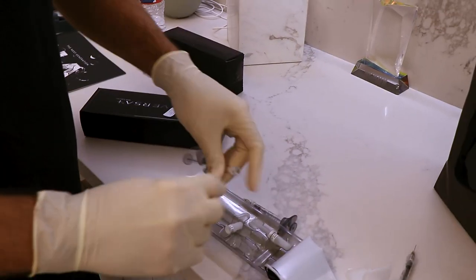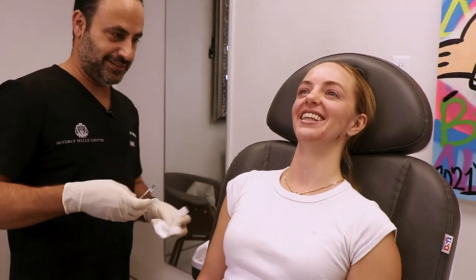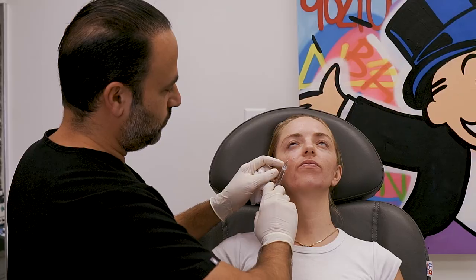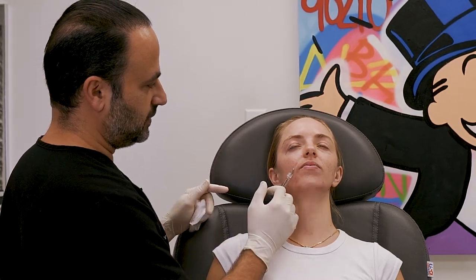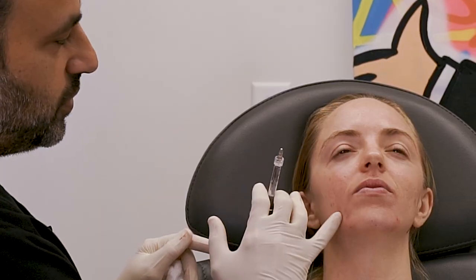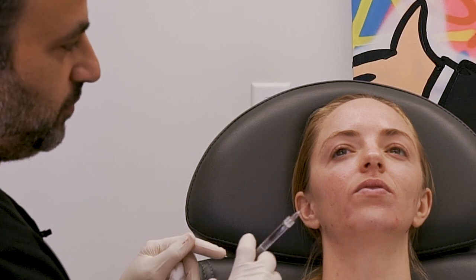Two ways to fill nasolabial folds: one is the actual fold to pop it out, the other is the crease that forms. Allison has stronger creases than folds, so we're going to worry more about that. We don't want to add volume because she has prominent teeth. People with prominent teeth and prominent maxilla don't have strong nasolabial folds — they're already pushed out and supported, but they do get creases because they're straining around their mouth so much.